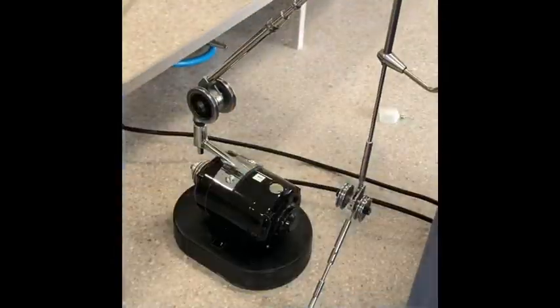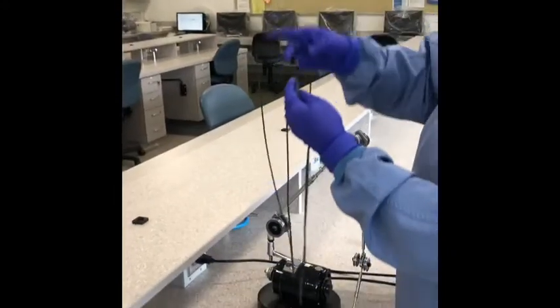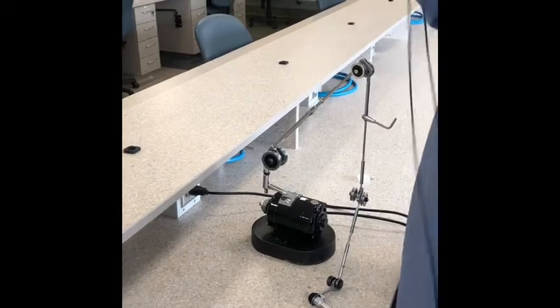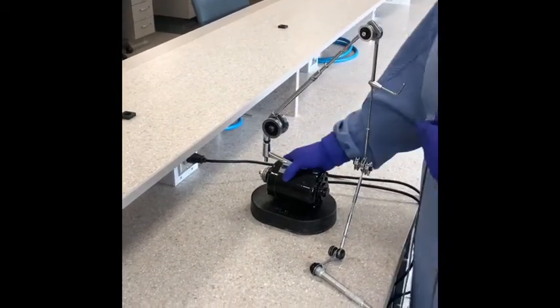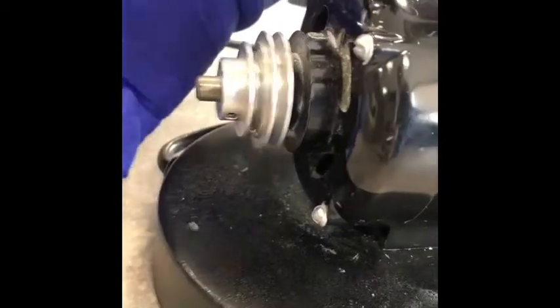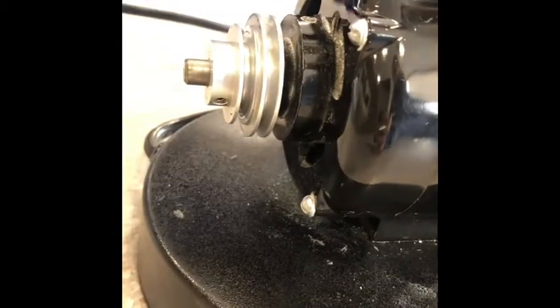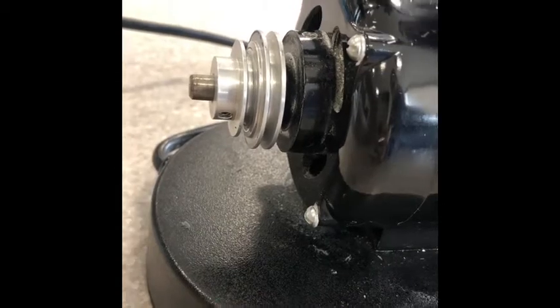And then you have this big belt here. Sometimes these become frayed or weak over time. They get worn out, so they do have to be replaced. But I do want to just show you how to place it back on the handpiece itself. So back here in the back, there is two grooves. So there's an outside and an inside. So it doesn't matter which one you place it on first. You just have to do the opposite up at the handpiece. So make it make a little more sense.